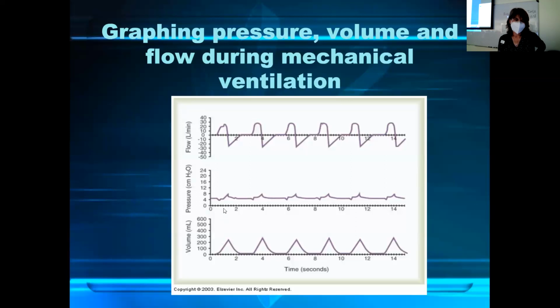Okay. So when the air comes back out, it's this little positive blip for a spontaneous breath. So air going in is the negative part. The positive part is the air coming back out of the lungs. And it's just not going to have obviously as strong of a positive graph as a ventilator. Right. Yeah. So this is spontaneous breathing.